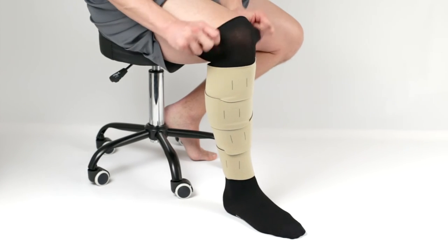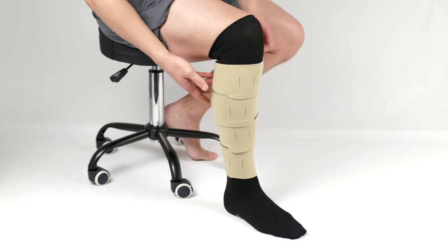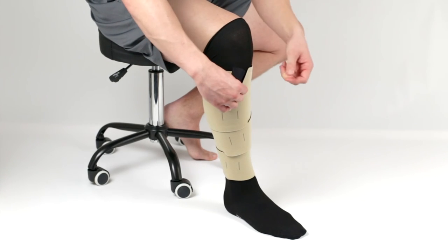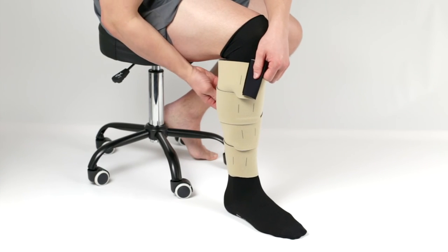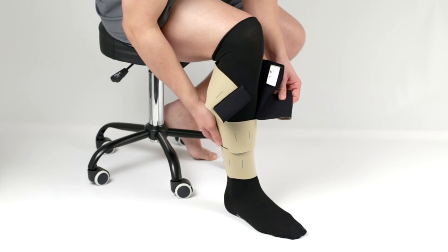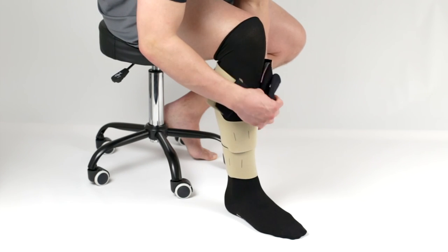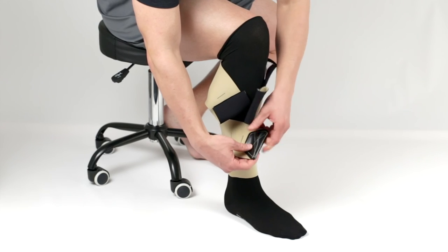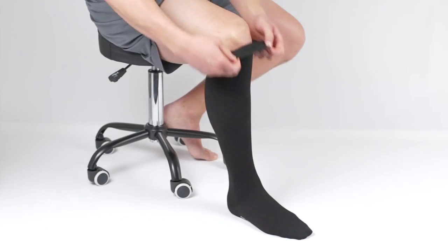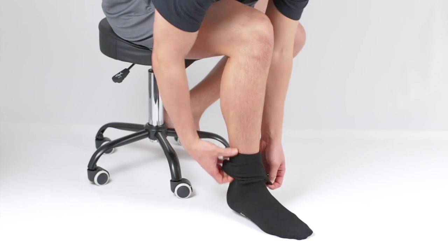To remove the CircAid JuxtaLite lower leg, unfold the compressive undersock first. Then detach all bands of the legging, starting with the top band. Fold each band onto itself to keep the Velcro tabs lint-free. Remove the garment and then remove the CircAid compressive undersock.